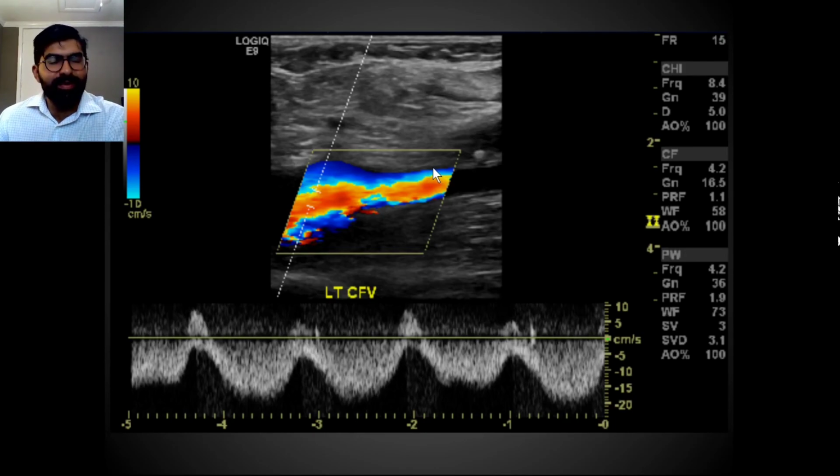So how is that really possible? Well, this is essentially the transmitted wave from the heart in a patient that clearly has congestive heart failure or sudden volume overload. So this is how you can differentiate the two. But again, a very cool picture. The increased pulsatility does represent congestive heart failure here.